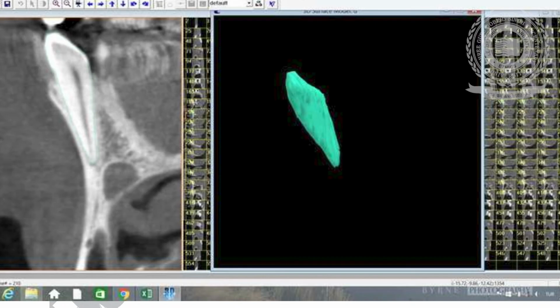One of the significant parts of forensic dentistry is age estimation. CBCT helps in non-invasive identification of age. Apart from the above discussed applications in dentistry, CBCT has uses in general radiology, mainly in otolaryngological, musculoskeletal, breast, respiratory and cardiac imaging. CBCT has also been used in spinal surgery. It is also used in interventional radiology and radiotherapy.